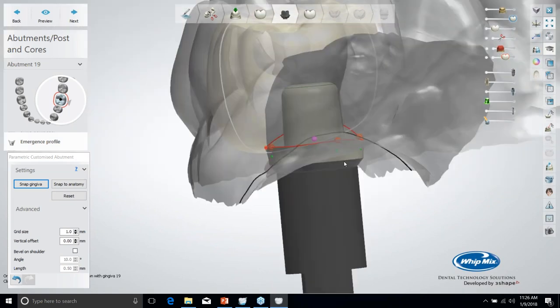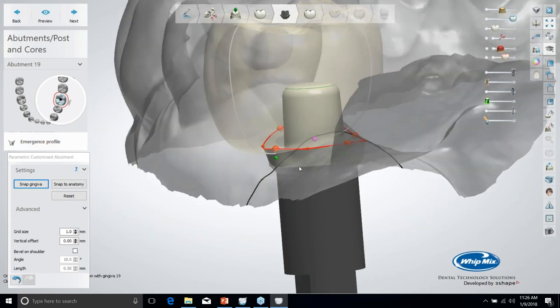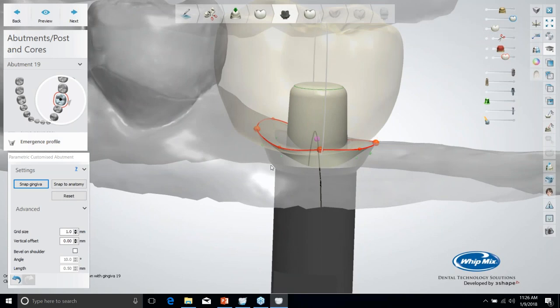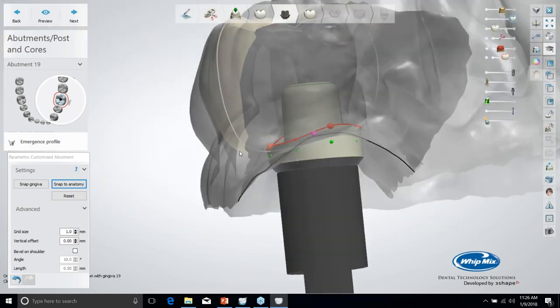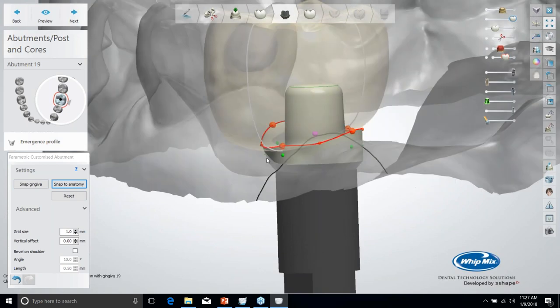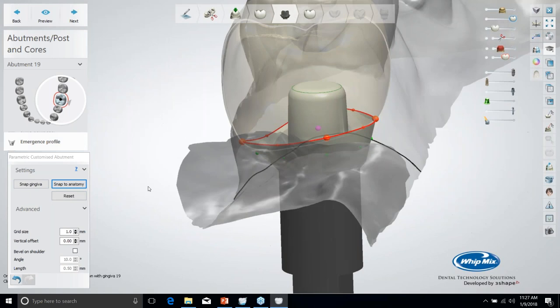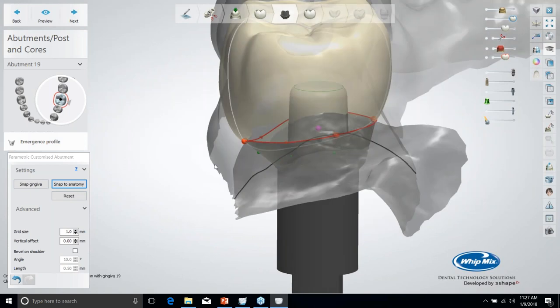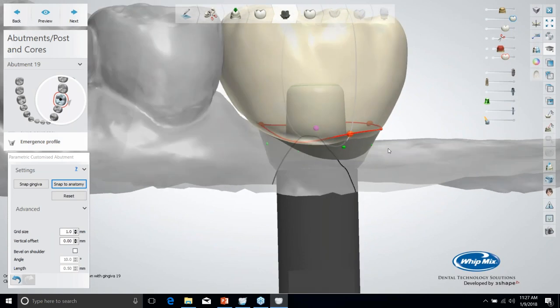So instead of seeing a line that slopes and follows a normal tissue contour, you would see it slope down to follow the profile of the healing cap, or however it was scanned. The next option you have is snap to anatomy, and that's going to try and snap to the closest point on that crown. Generally, I'll try snap to anatomy and see what it gives me. And if it looks like it's going to match all right and not be in the way, then I'll go with that.